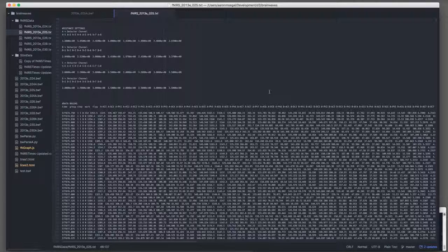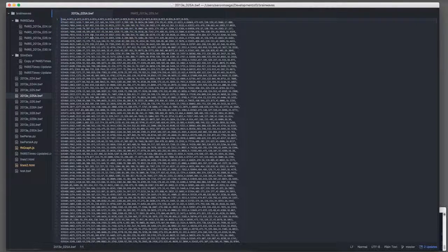So the first part of my project was actually building a Python script that took the format that these different scanning data came out in and basically stripped out just the information I needed and put it in a comma separated format here. So this is an example of the same file, but parsed down to the information that my interface actually needed. And the reason I went with comma separated is I ended up making my application a web application, and it uses a library called D3 to do graphical representations of data. And D3 has a really nice library for basically taking comma separated values and quickly building different types of interfaces and graphics out of them.